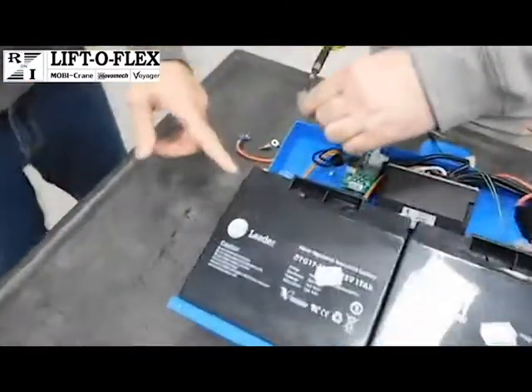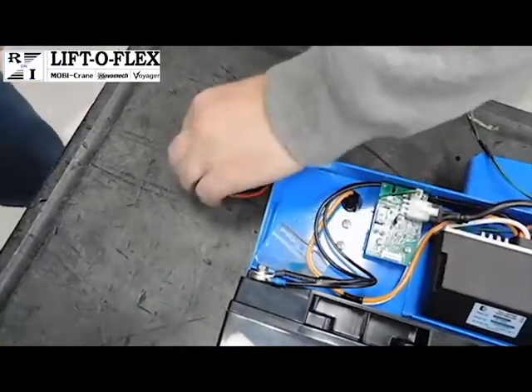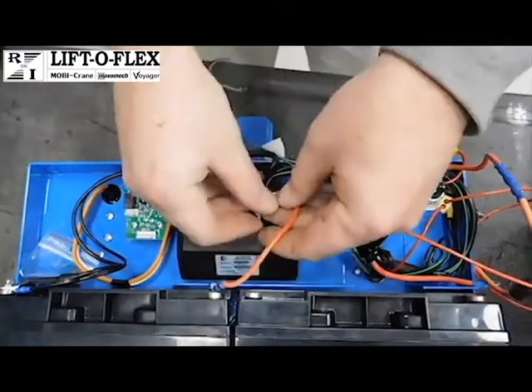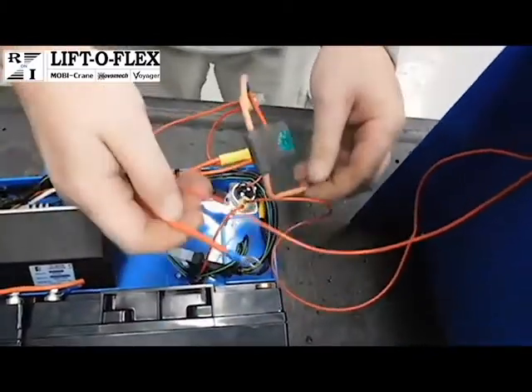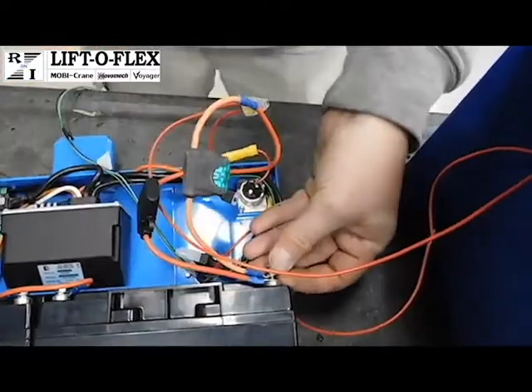The negative terminal is put to the left battery negative terminal. At the center location, you join the positive from the left battery to the negative of the right battery. And then the positive power comes out of the right terminal of the right battery, and that feeds the power to the Curtis card and the auxiliary output.